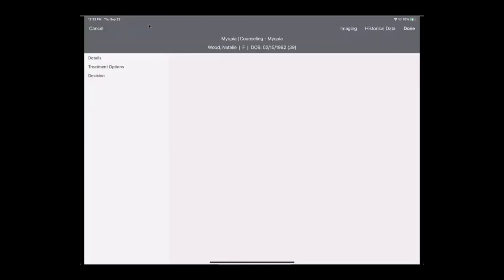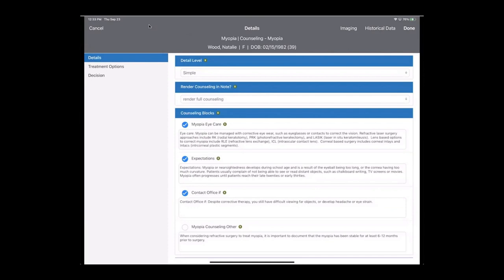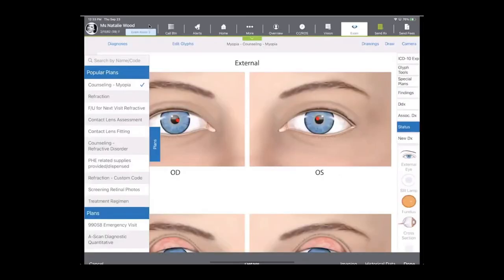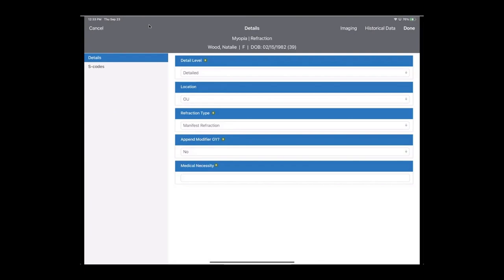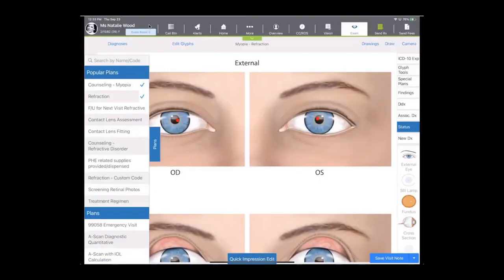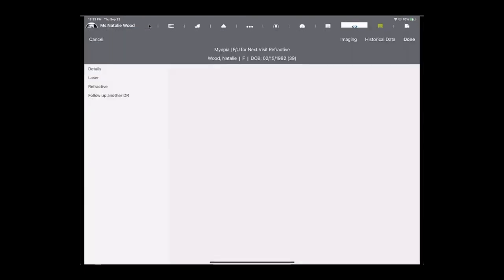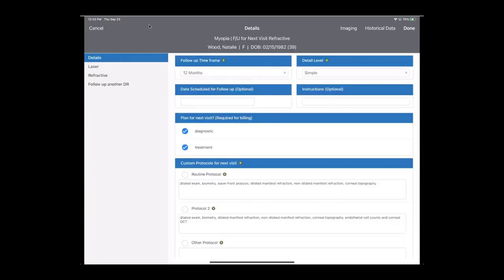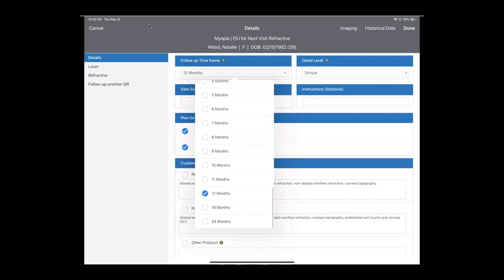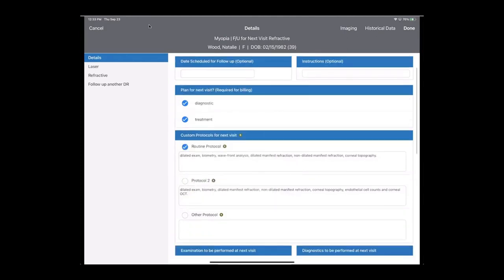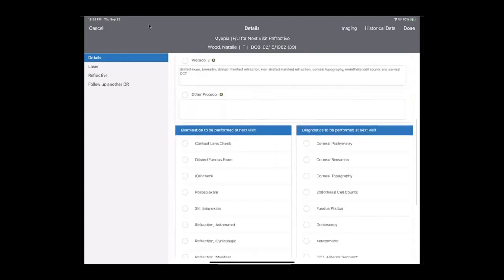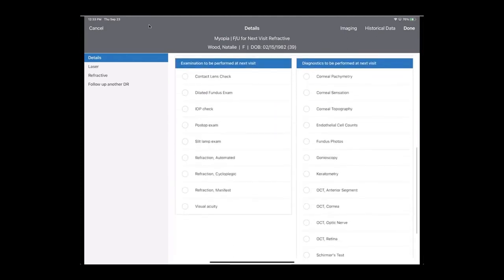When I tap on the counseling for myopia, you'll notice that the counseling blocks, the verbiage that I've used in the past, that I've approved in the past, is going to come to the top of the list. I can customize it for this patient, but if you like the verbiage, you've used it before, and you want to use it again, it's here for you in a library. We can list our refraction. And then we want to see the patient again in a year, which is already pre-selected for us, for routine protocol, and order fundus photos.